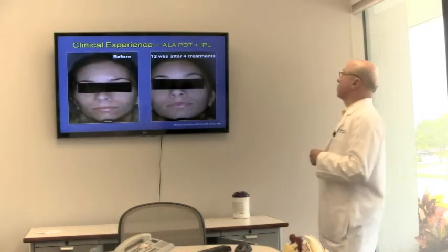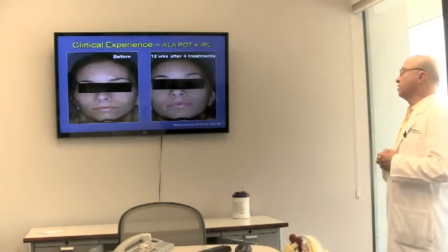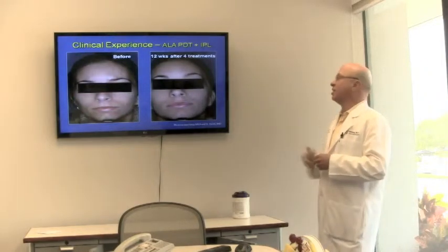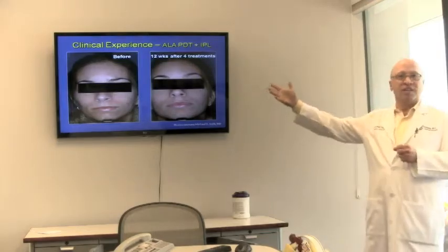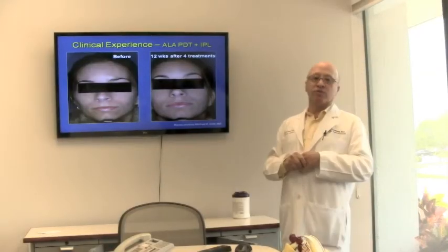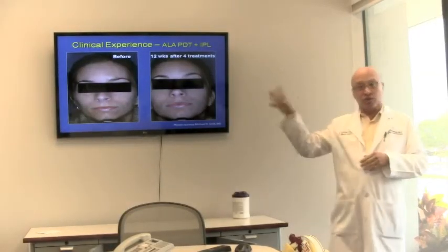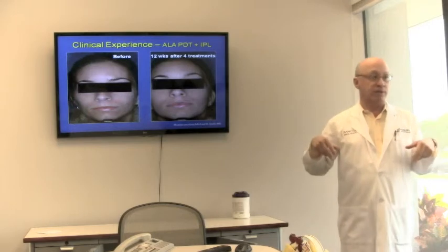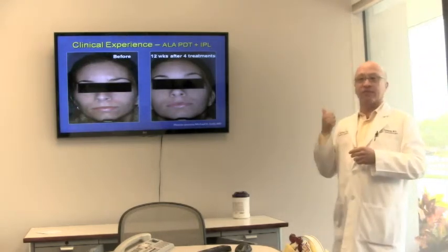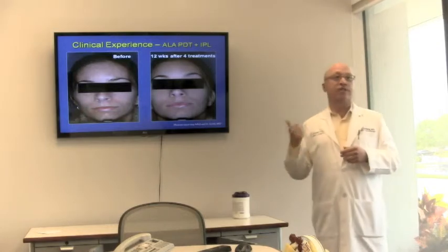And so this is Michael Gould. Now this is PDT. Now you could argue that the same result might have occurred if they just used light alone, but she's got a lot of inflammation. And so that's when I start thinking about PDT. It's not just that they have pimples. And so the issue with photosensitization, which is an issue when you start throwing in the ALA, is that, just like any other PDT patient, they have to wear sunscreen for 48 hours afterwards, not do that well.